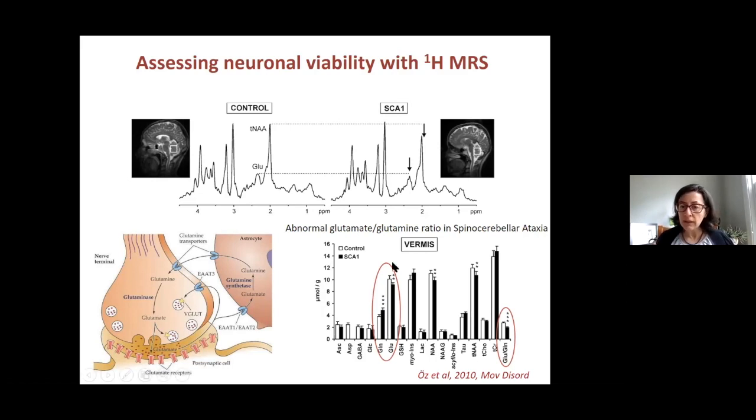And in this disease, we happen to see changes both in glutamate and glutamine. And if you look at their ratio, the glutamate-glutamine ratio, you get an indication of neuroglial deficits. So perhaps an abnormal glutamatergic activity can be indicated by this reduced glutamate-glutamine ratio.